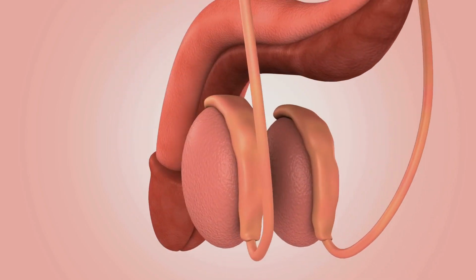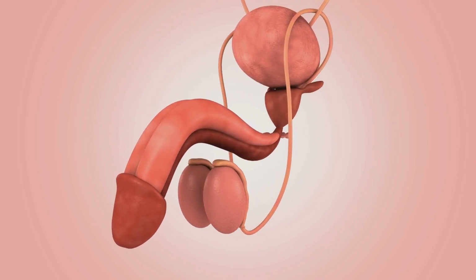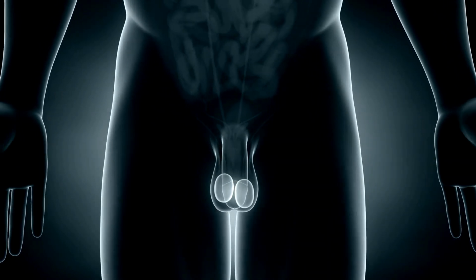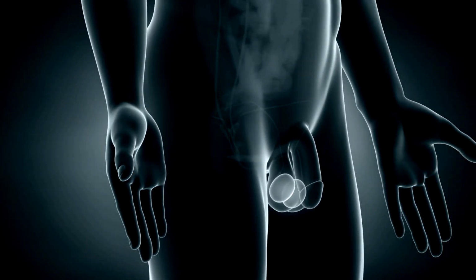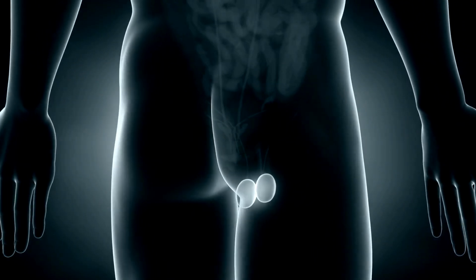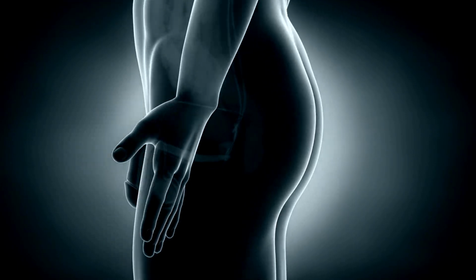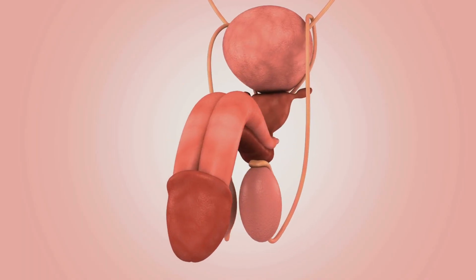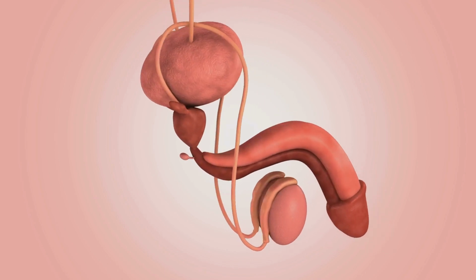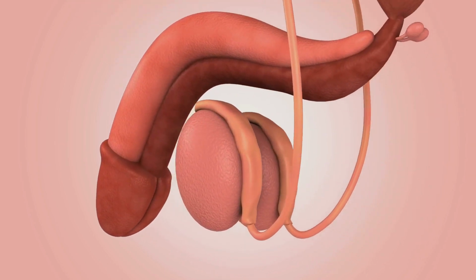You have to know that this is a surgical procedure. The natural erection is replaced by one that is mechanical. For inflatable implants, a pump located in the scrotum between the testicles is activated and pumped up to move the fluid, a sterile saline solution, from the reservoir, located usually behind the abdominal muscles or in your pelvis, to the cylinders located in the penis so that you can get an erection. After sexual activity, another button on the pump system is pressed to move the fluid back to the reservoir, causing the erection to go down.